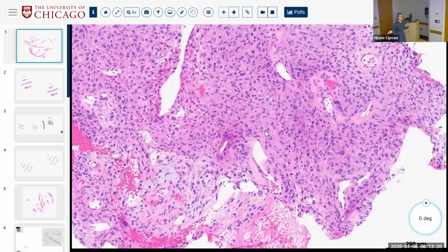It's got nothing. It may or may not have some myoid markers, like an SMA-ish thing, because fibroblasts and myofibroblasts are kind of interchangeable, okay? But other than that, there's no specific lineage of differentiation. There's no specific genetics, right? And there's no specific immunoprofile, right? So you're basically excluding based on morphology, and you're excluding the other known soft tissue sarcomas that this could be. Questions? Okay.